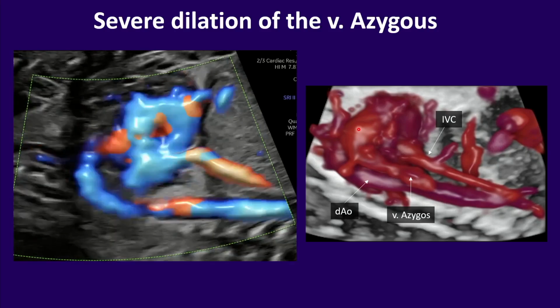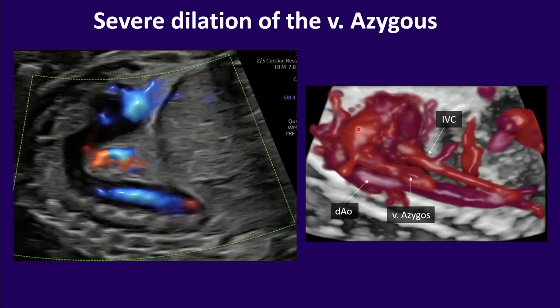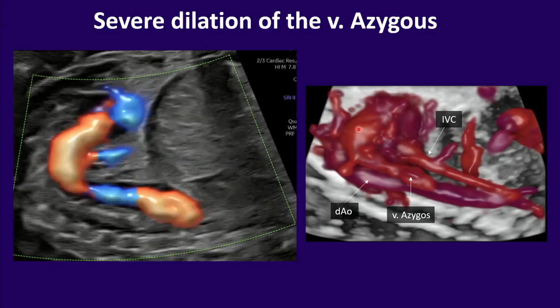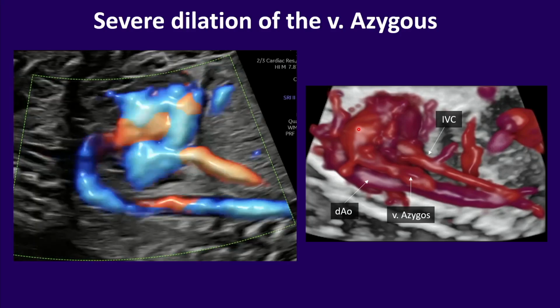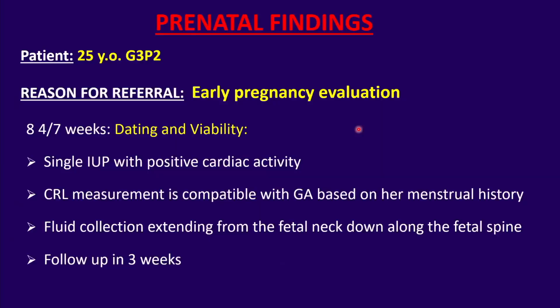So, 2 important things to highlight in this case: the color Doppler is important, following the protocols is important, and basically it's very important to understand the physiology, and that sometimes the heart can be affected due to some extra-cardiac problems. All right, so now I think we are ready for the next case.